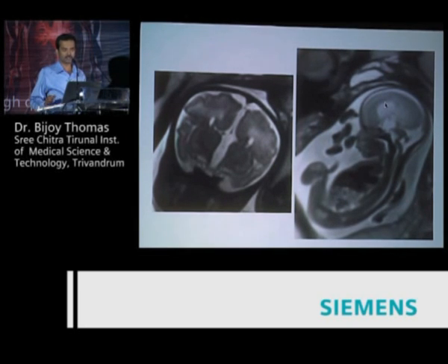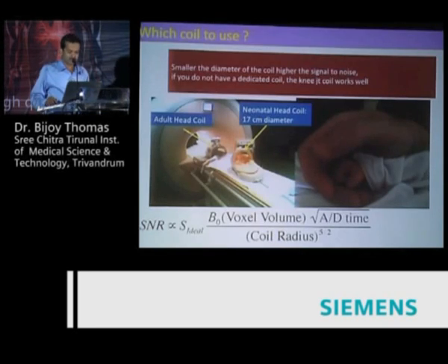All these things you can actually do within 20 minutes. You need to start with localizer scans of the abdomen. You can say which side of the fetal abdomen corresponds to the mother's left or right, and you can give a very comprehensive report, which is very extensive in Sick Kids. So these are again some borrowed slides from Dr. Shroff, because I don't have clear-cut first-hand experience, other than the fact that I did a fellowship where I was doing all these things abroad.